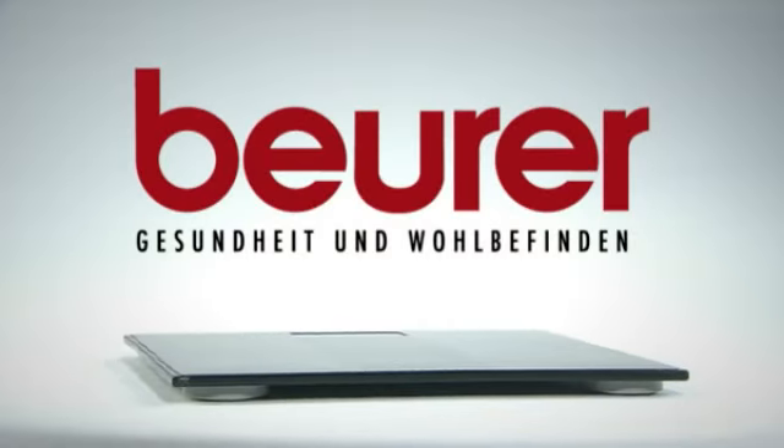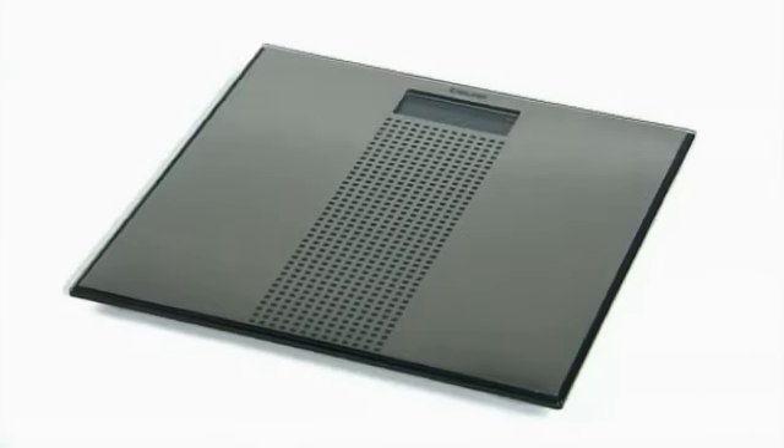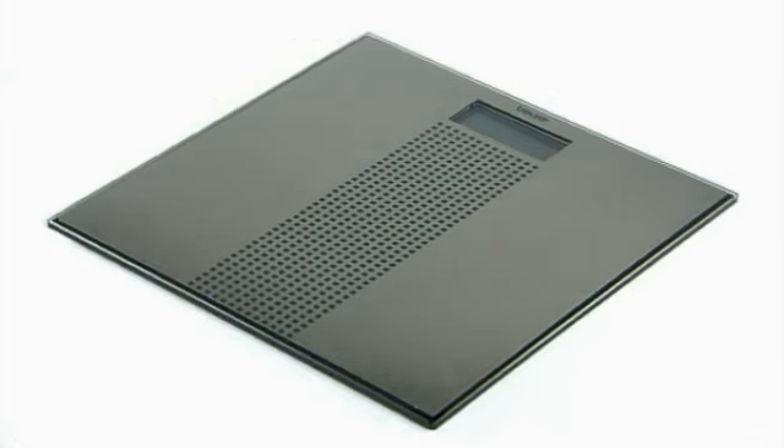An ornament for your bathroom, the Beurer GS36 design line glass scale with top quality stainless steel finish.